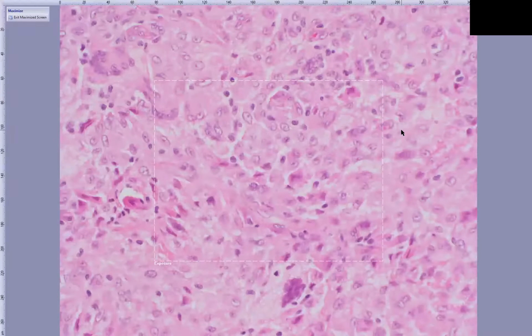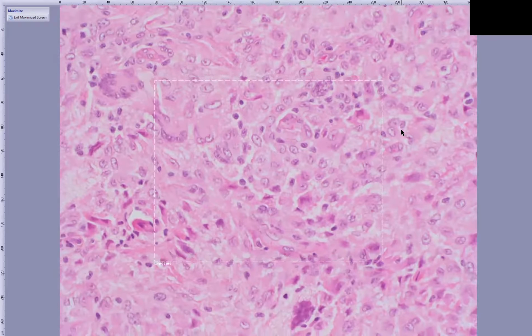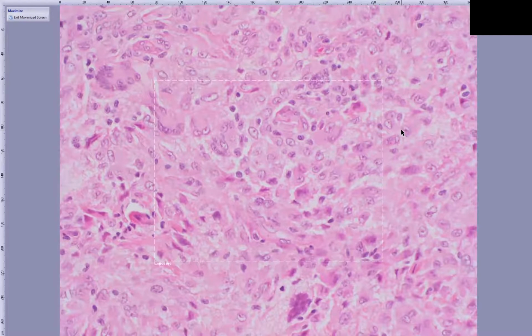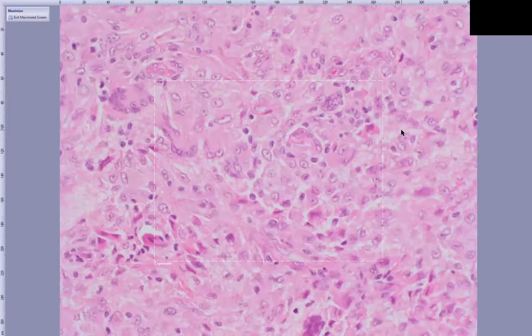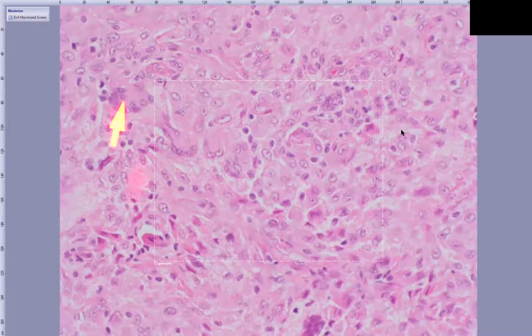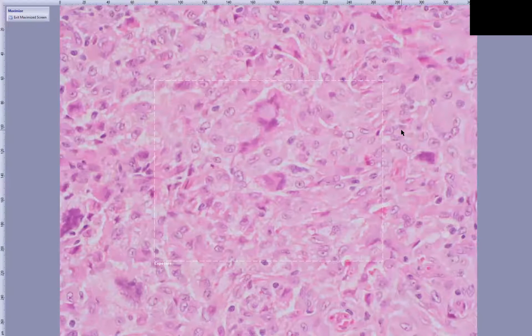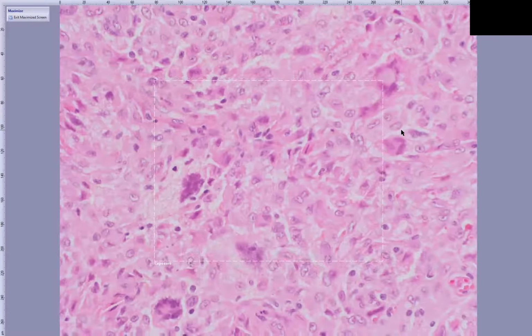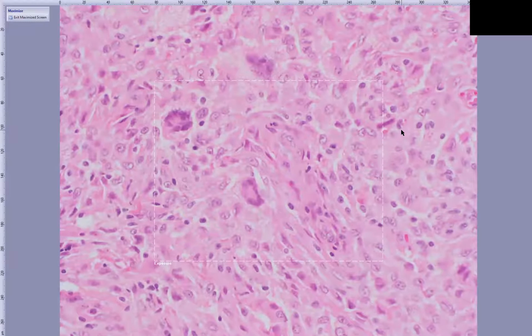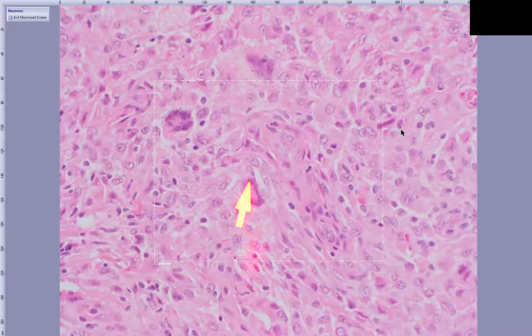Okay. Admixed with these epithelioid histiocytes, though, are multinucleated giant cells that are of the same cell, so they're giant cell versions of the epithelioid histiocytes. And you can see them in this view here. You see multiple giant cells. What's characteristic about the giant cells in juvenile xanthogranuloma is that they tend to be of a certain type called the Touton giant cell, which in its classic appearance is composed of nuclei that are arranged in a wreath-like pattern at the periphery of the cell.